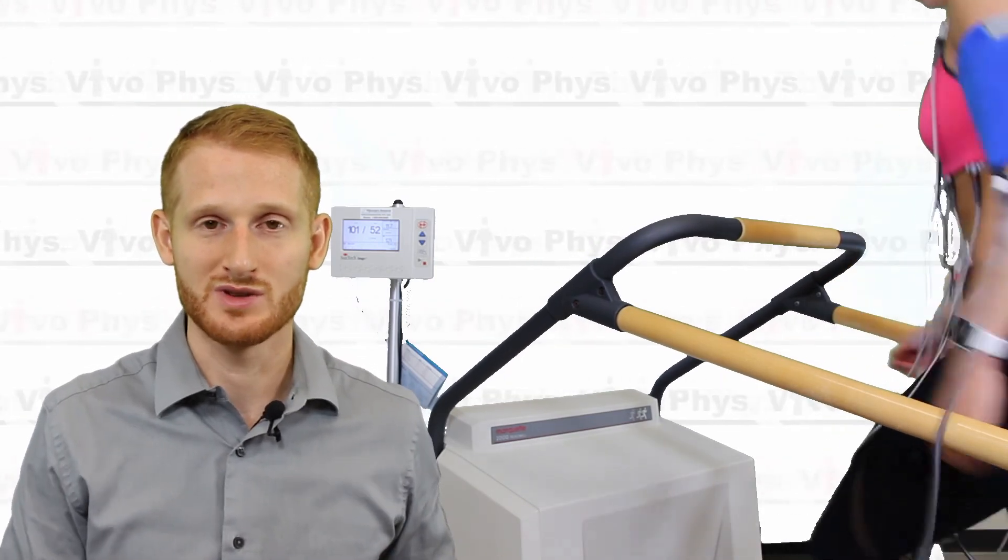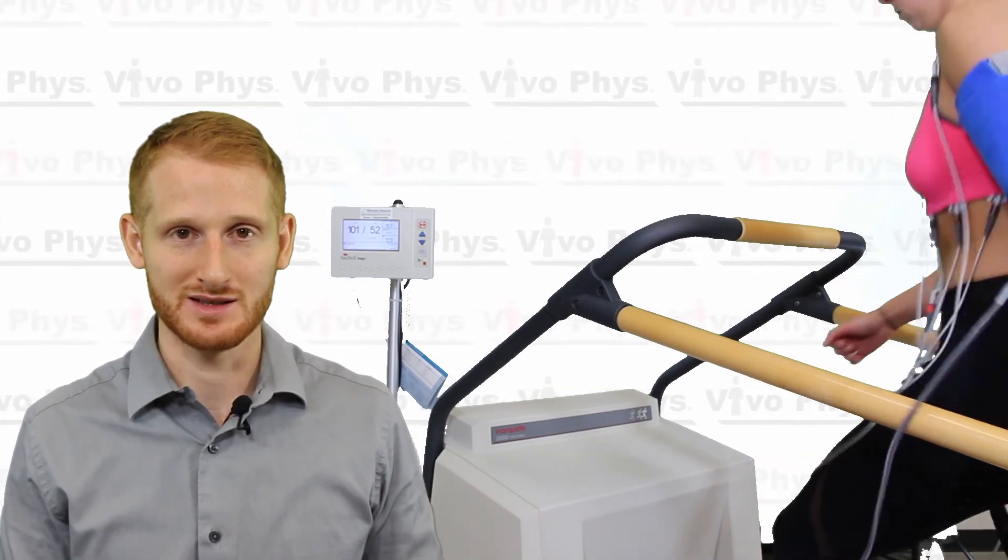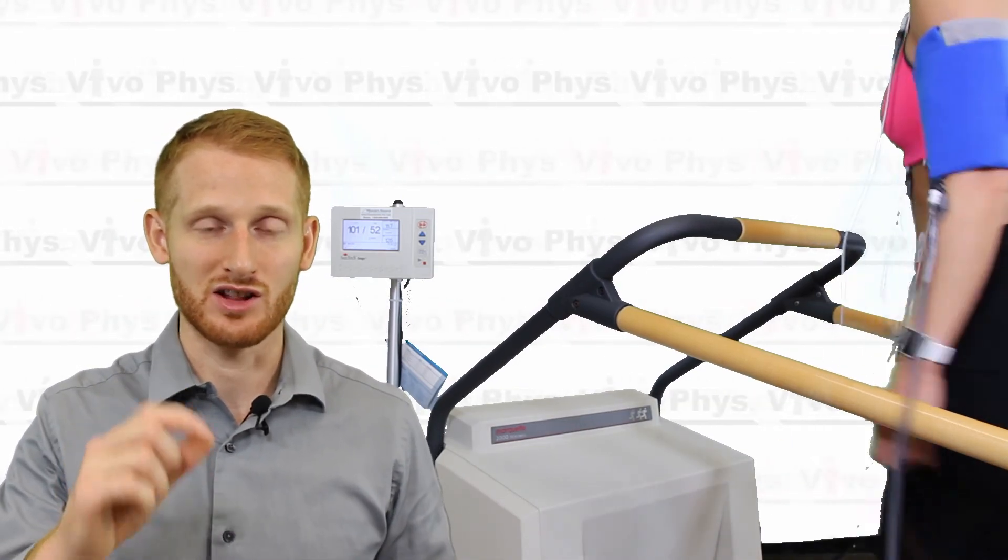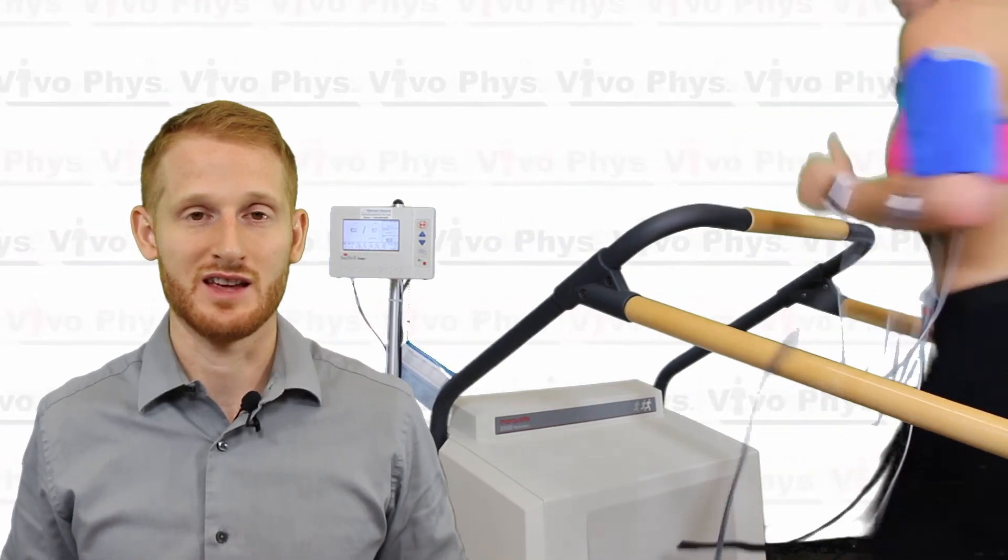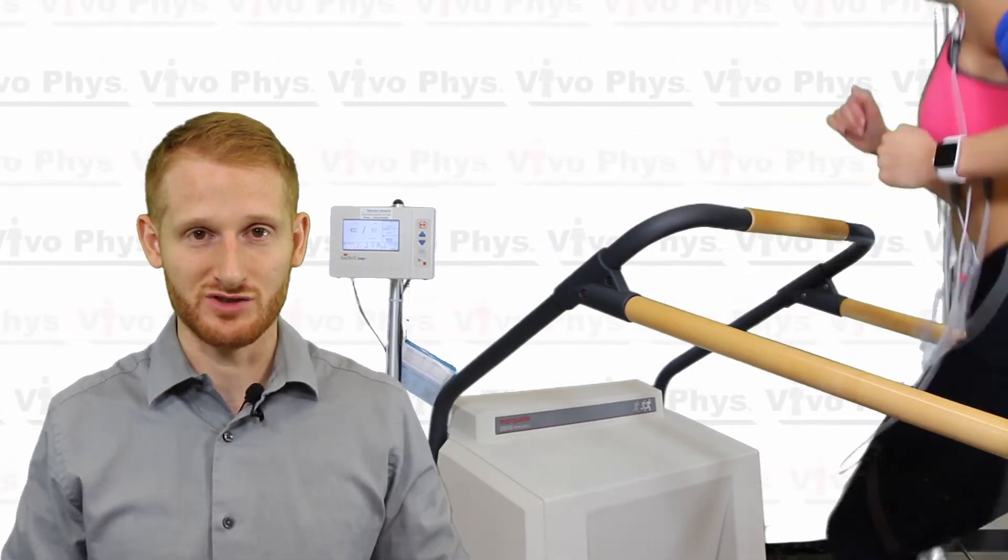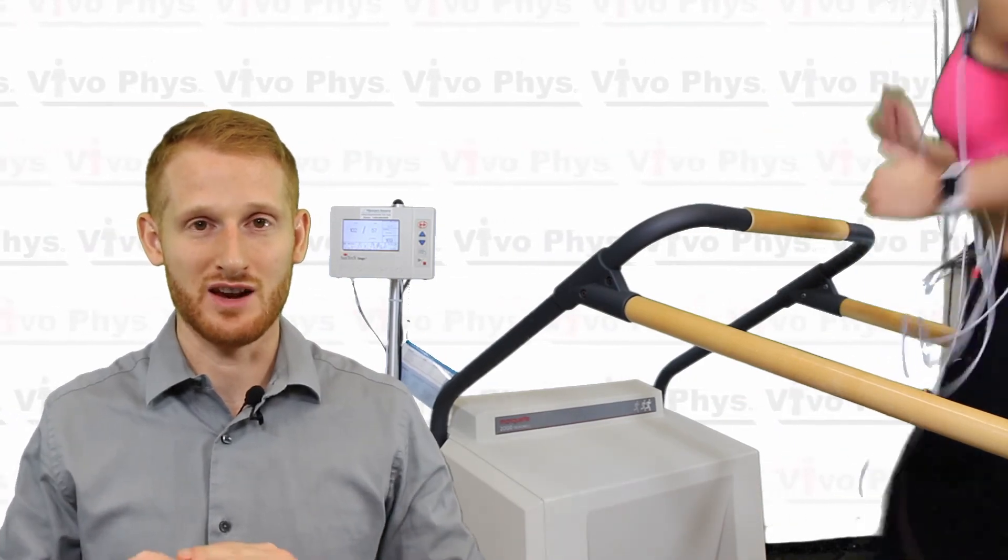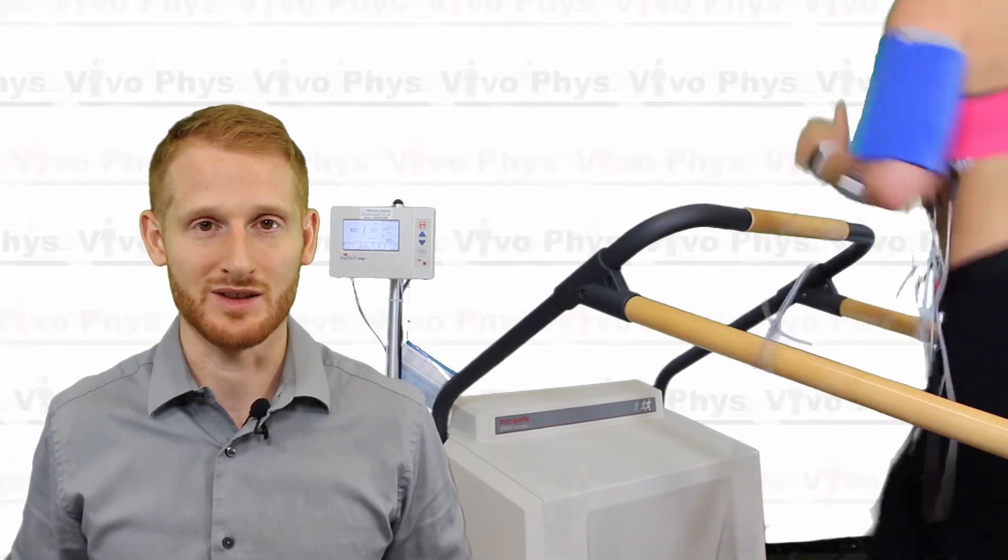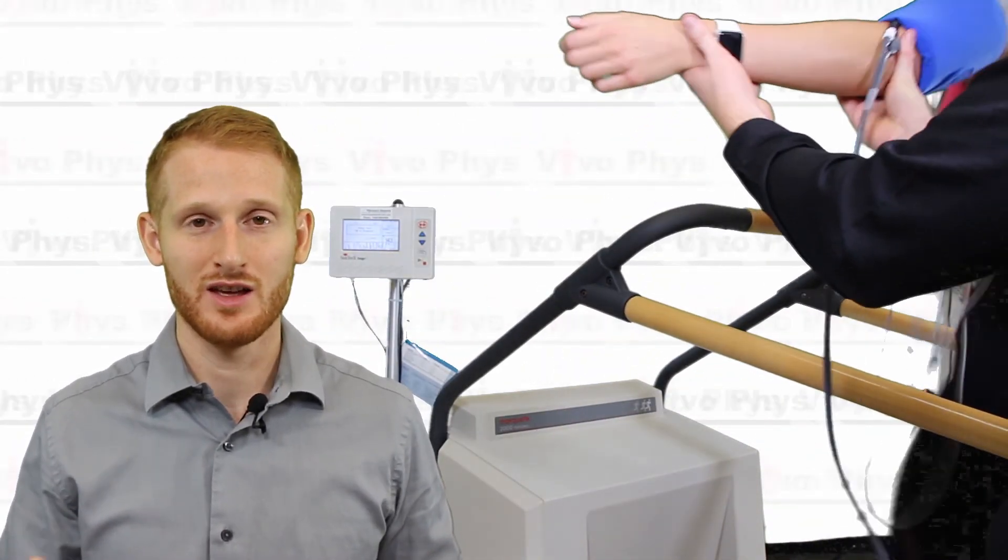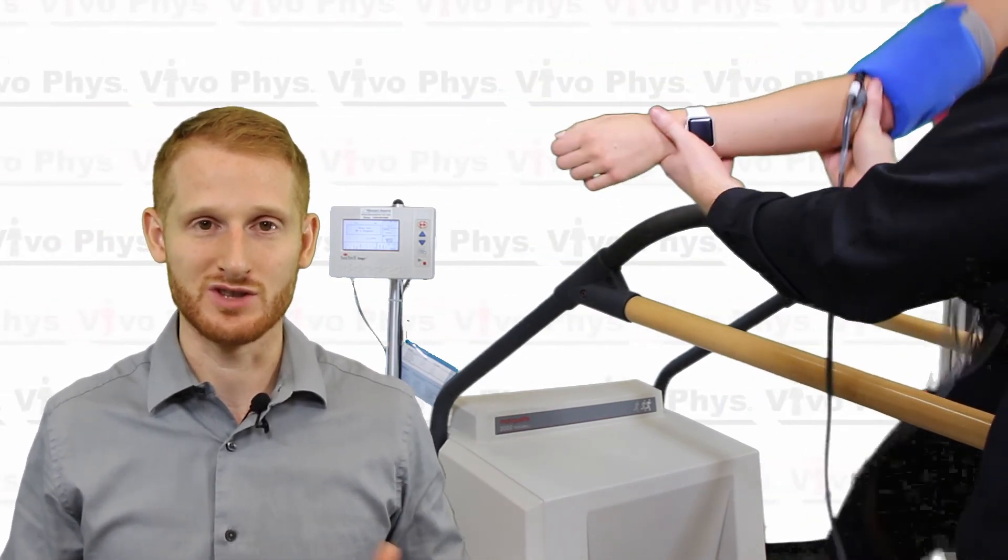The treadmill is going to go up in speed and grade every three minutes and all those measurements I just listed should be done at least once per stage typically in the last minute. Make sure that you remind the person that they're in control of the test. It stops when they think it should stop. Whenever they want the test to stop tell them to grab the handrails and straddle the belt so they're not standing on it anymore and that signifies they are done. You on the other hand also are looking for reasons to stop the test. Any sort of electrocardiogram abnormality or if you just got to whatever endpoint you were looking for for the test then you stop the test yourself.